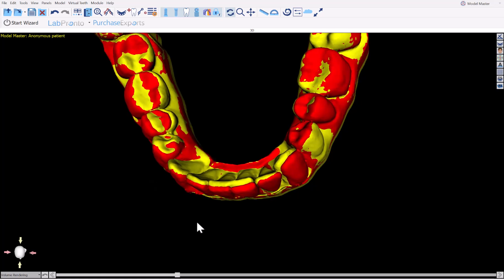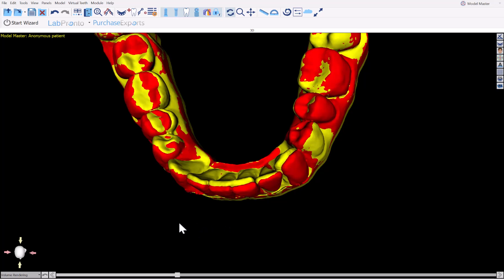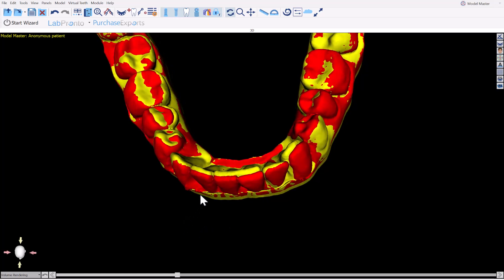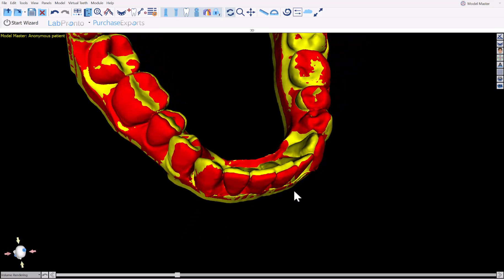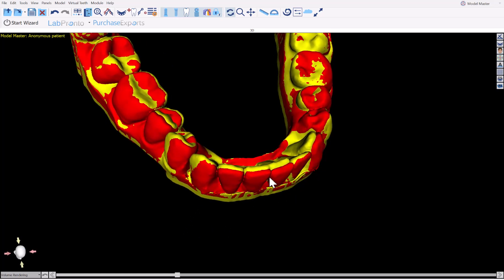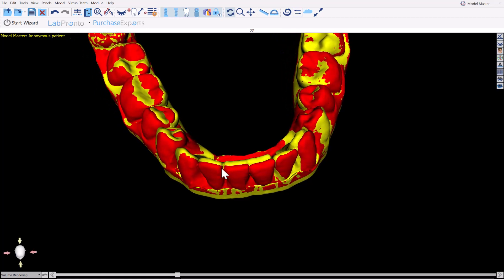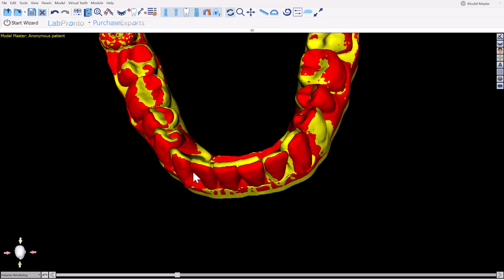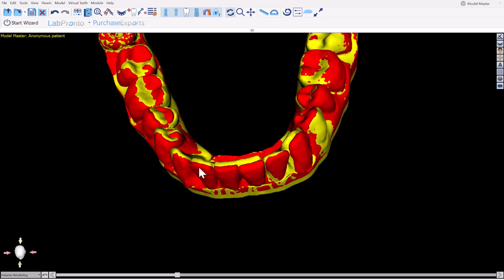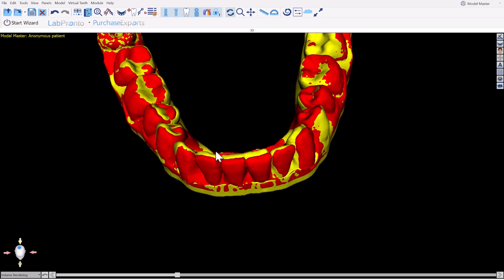The yellow model is based on an optical scan with limited crown-only information as has been done for years. The red model is based on segmented CT teeth, true anatomical data.